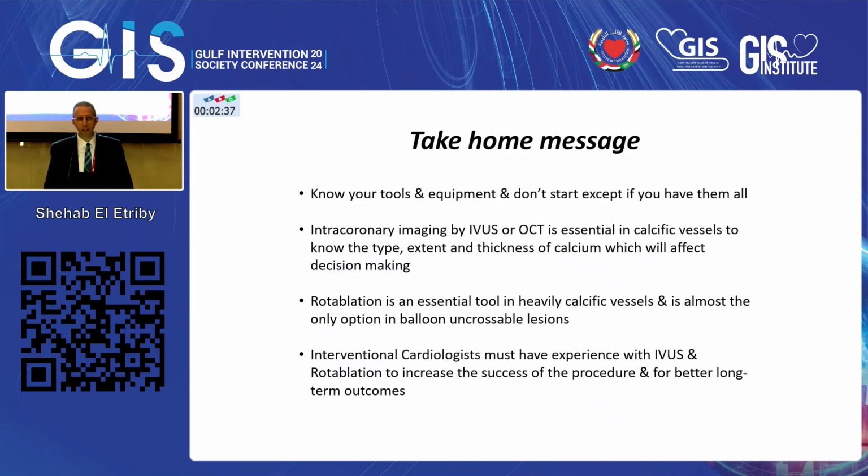So my take-home message is that you must know your tools and equipment and don't start except if you have them all. In this patient, he had a heavy calcification and the operator tried to open it despite all this calcification without having rotablation or cutting balloon or scoring balloon in his center, which I think is very wrong. Intracoronary imaging by IVUS or OCT is essential in the calcific vessels to know the type, extent, and thickness of calcium, which will affect the decision making.